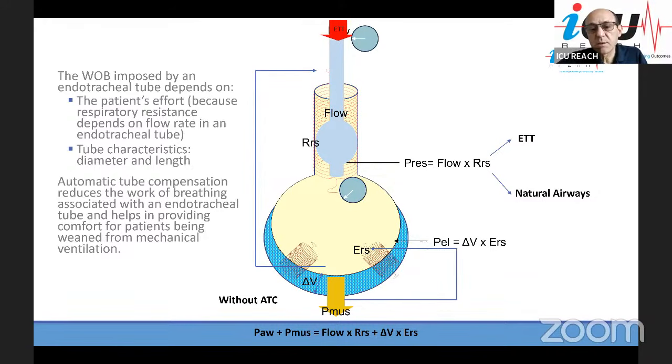And not only that, we adjust this pressure from breath to breath to overcome the resistive load of the ET tube and the variable flow through that ET tube because of the variability in the inspiratory flow of the patient, I'm sorry.